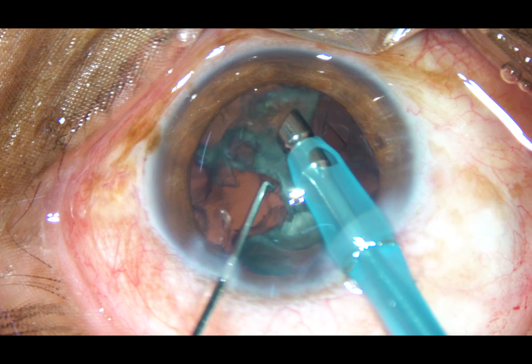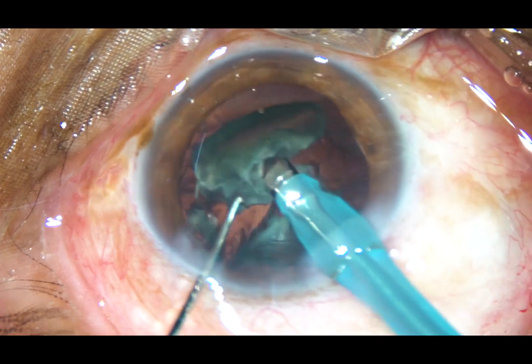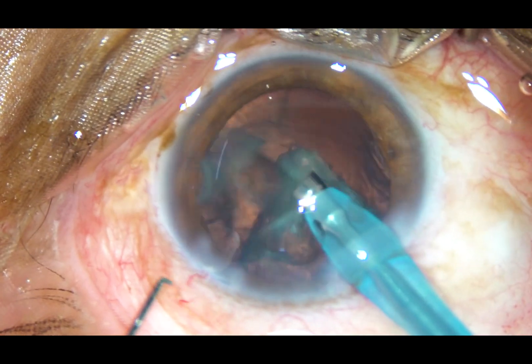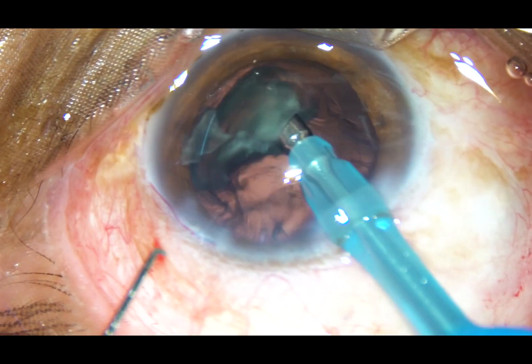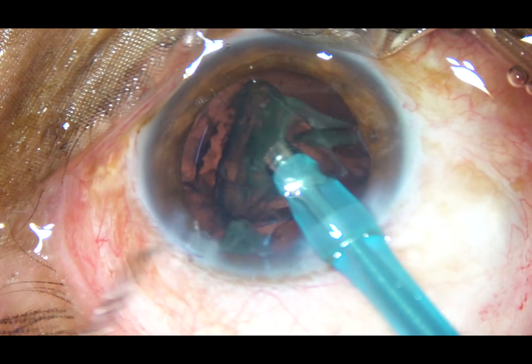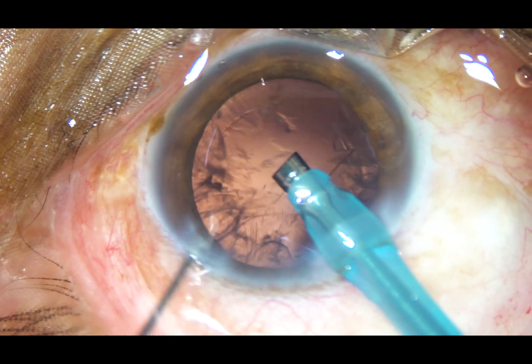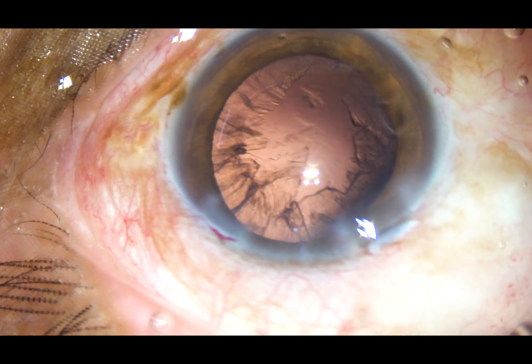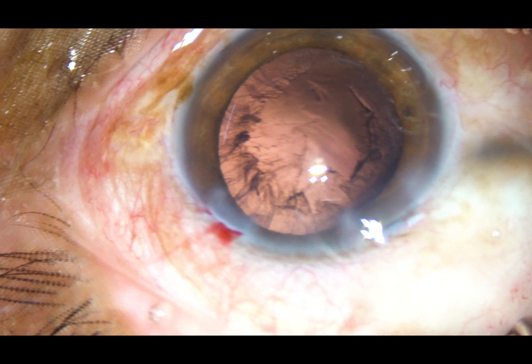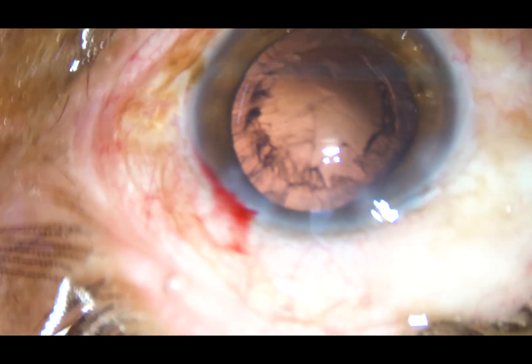This is the last piece. We must be very careful during emulsification of this last fragment. I usually remove the chopper — what happens is the anterior chamber becomes more stable because leakage from the side port stops, and I can very safely emulsify the last piece with the same settings.